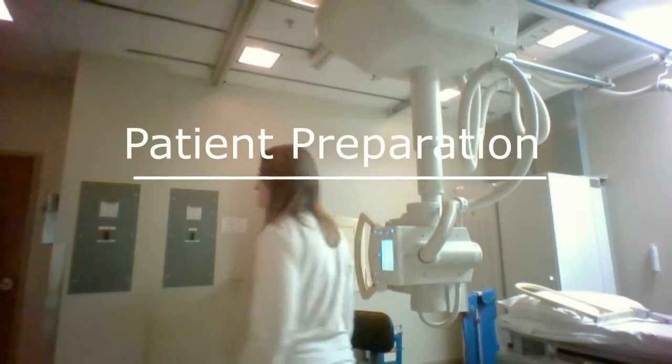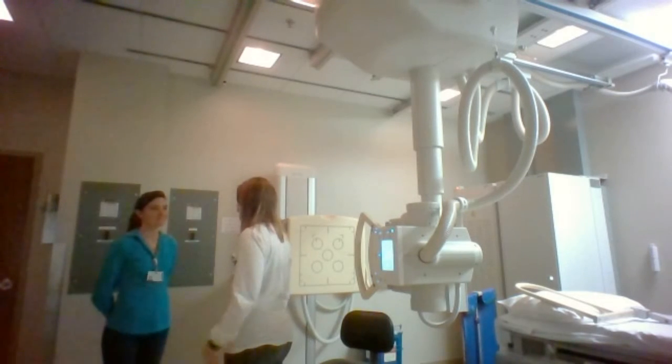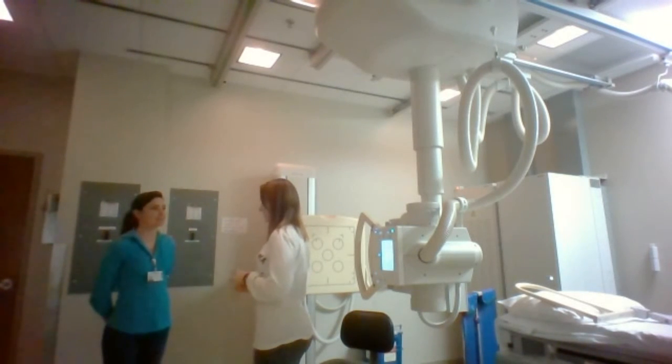Okay. Sky, come on in. Hi, I'm Sarah. I'm going to be taking your x-rays today. Hi. Can you tell me your full name and your birthday? Yes, Sky Straub. It's May 9th, 1987. Okay, and is there any chance of pregnancy at all? No. Okay. So why are we taking sinus x-rays today?